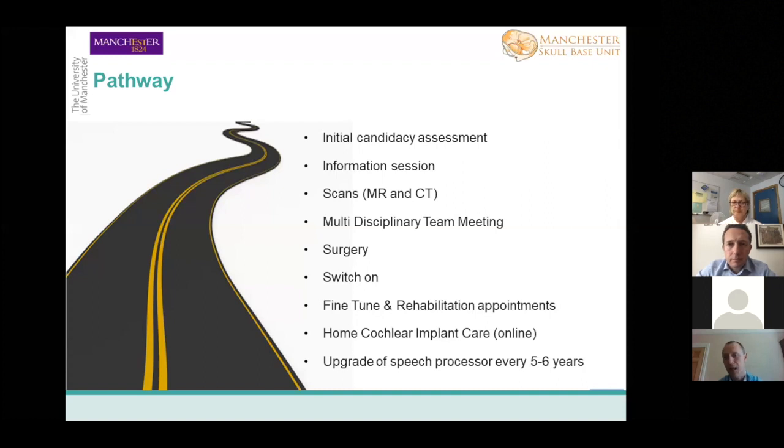That's definitely helpful. It's surprising how many so-called idiopathic hearing losses end up being something like otosclerosis. And that does affect what we do for cochlear implantation, because otosclerosis has an increased risk of facial nerve stimulation because of the quality of the bone. We would then tend to go for a modiolar hugging array like the Contour. So it does change our outcome.